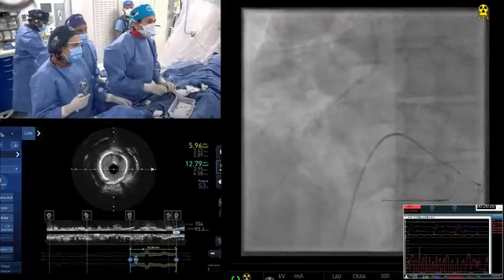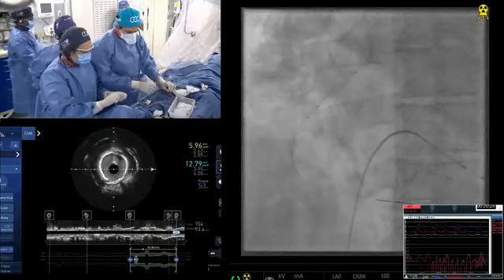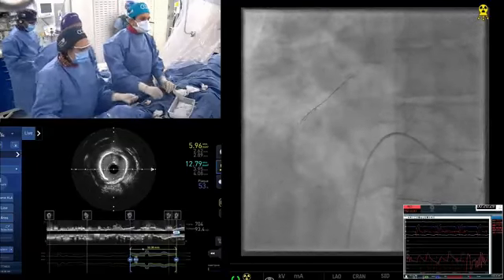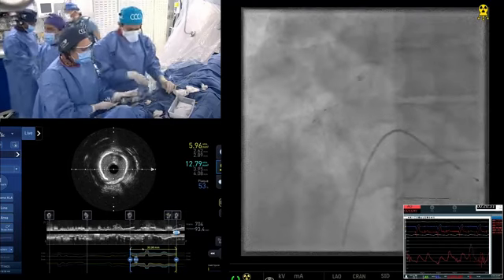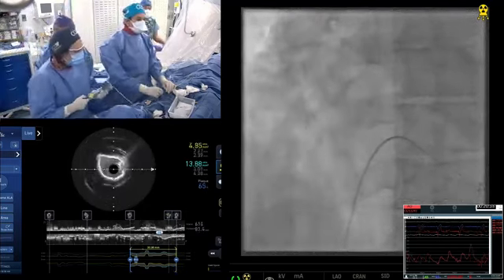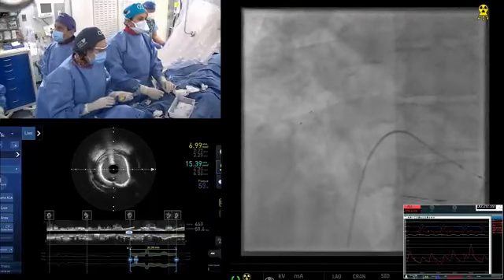Your rota wire is still there? Oh, you take it out now. Now you'll be 5 blades otherwise. Excellent. No, it can cause perforation. Remember, 5 blades are not good, because 4 from the 3.5 cutting balloon, and you put a rota wire, this will be the 5th blade. And I have one case. I think we should have then stented the distal. Okay, go up. Yeah, I'm worried about this.